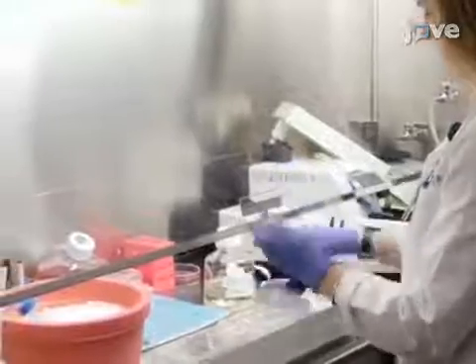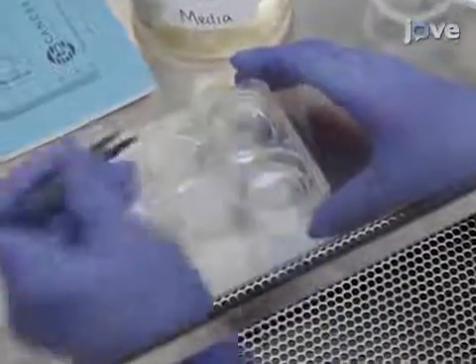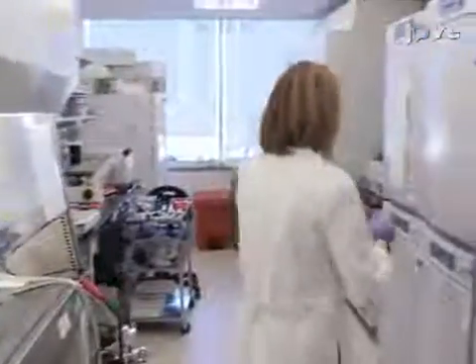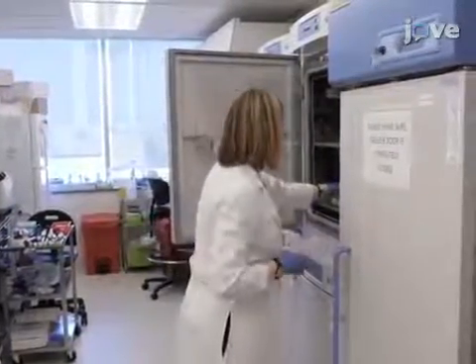Begin by using sterile forceps to place empty PTFE culture inserts into each well of a six-well plate containing one milliliter of slice culture maintenance medium per well. When all of the inserts have been added, place the plate in a humidified, water-jacketed tissue culture incubator at 37 degrees Celsius and 5% CO2.